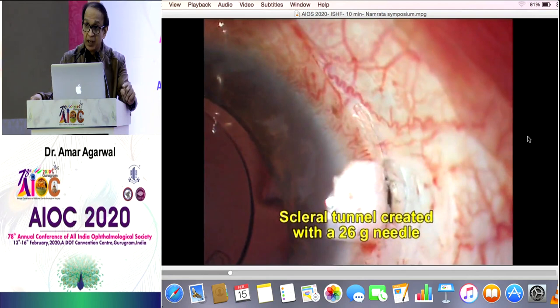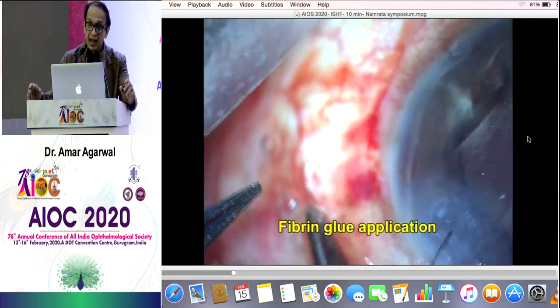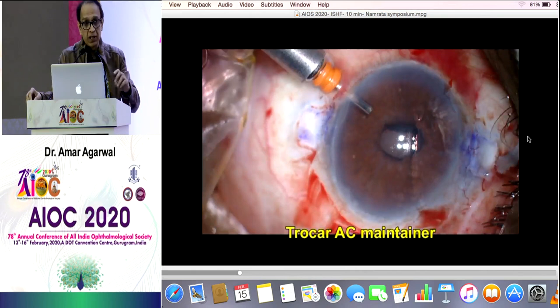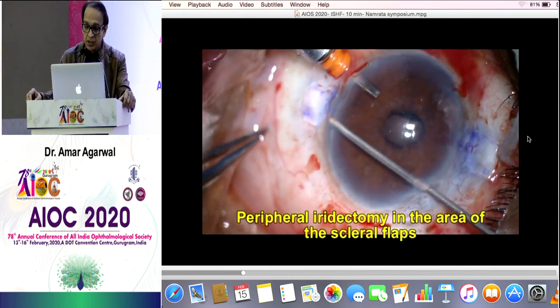But in this case, I can tuck, untuck, depending on where I want my ring to be. And that's the advantage in this. Now look at another patient. This was sent to me by Kapil Vora, one of the top surgeons from Haryana. You know, the Haryana Express. And this was a VIP patient he referred to me.